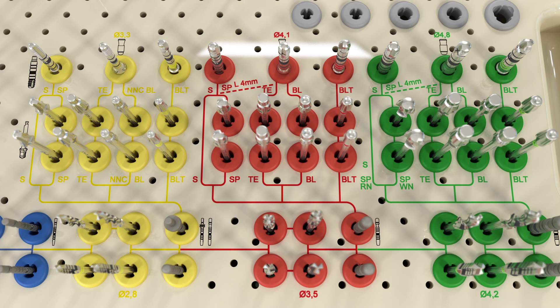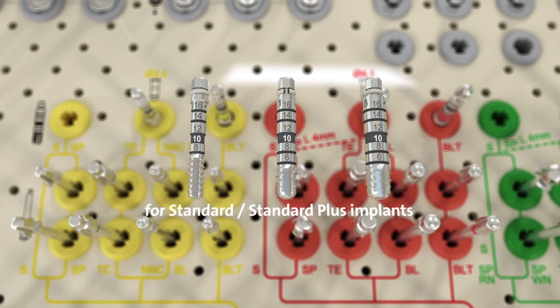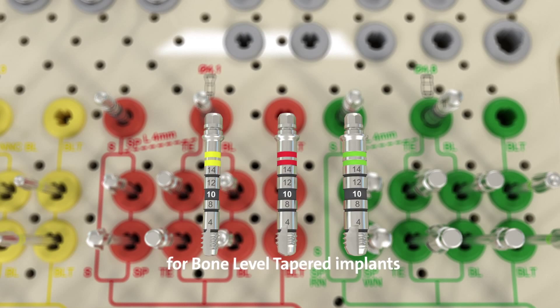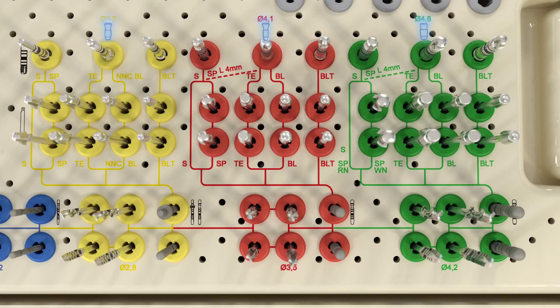The tap compartments in the cassette are clearly marked, and the color-coded system indicates what implant diameter the taps are used for. There are three types of taps: for the standard and standard plus implant lines, for the bone level, tapered effect, and NNC implant lines, and finally the taps for the bone level tapered implant line. All taps are identified by marks on the shaft. The workflow lines navigate the user from a profile drill to a specific tap according to the surgical protocol for the implant.